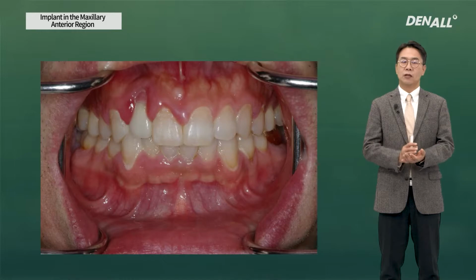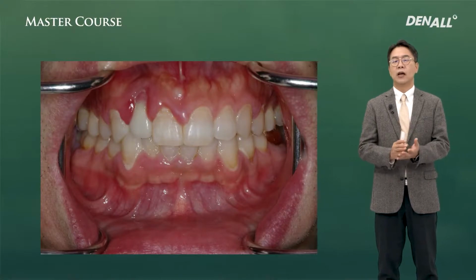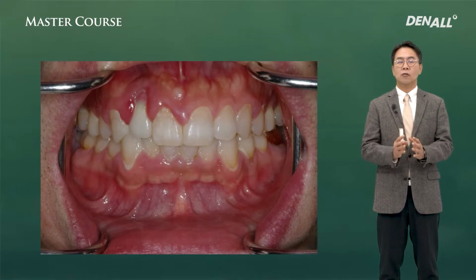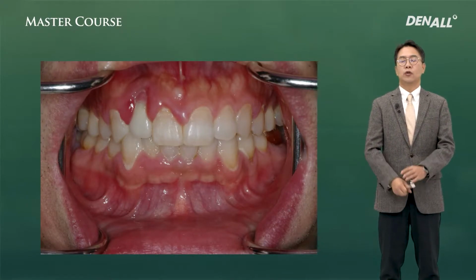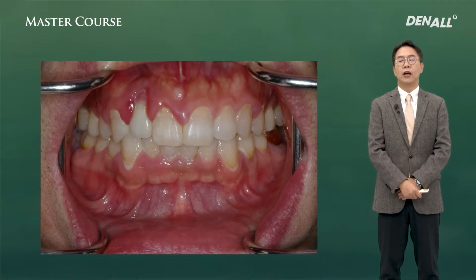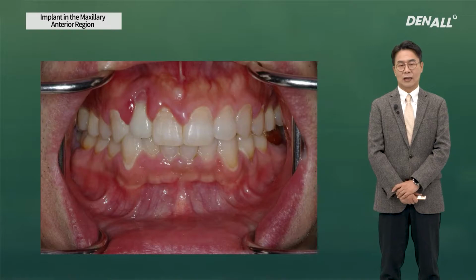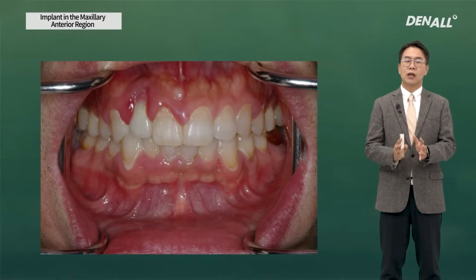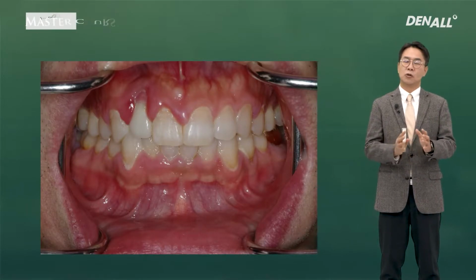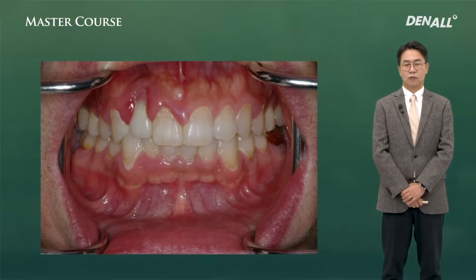I believe the doctor did the surgery after considering, for example, the implant placement depth and the surrounding bone and soft tissue before the surgery. I believe the doctor tried to make the outcome very similar to the natural tooth as much as possible. But I still think the pre-op preparation was not good enough. So I think to make up for that, another prosthodontic approach was used. However, at a glance, you can easily say it is far from being aesthetic.